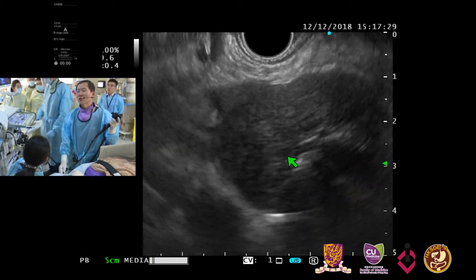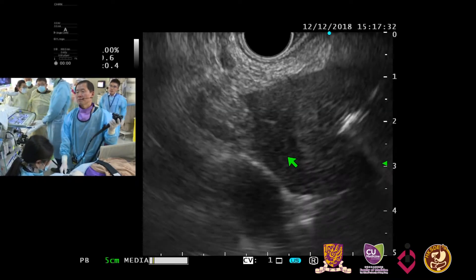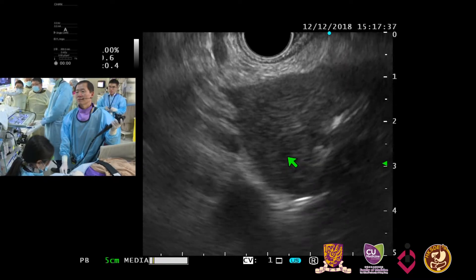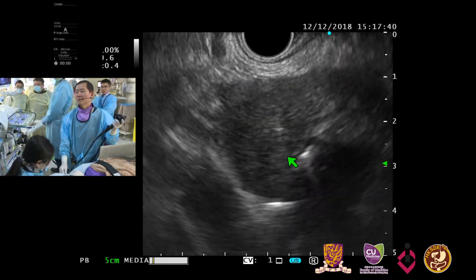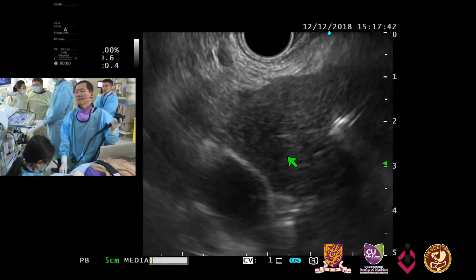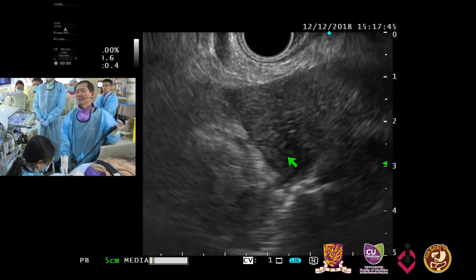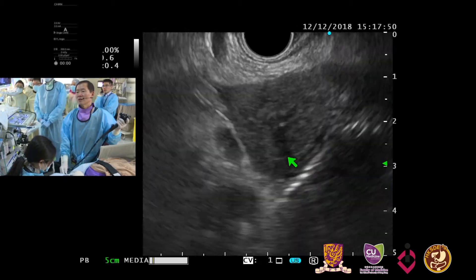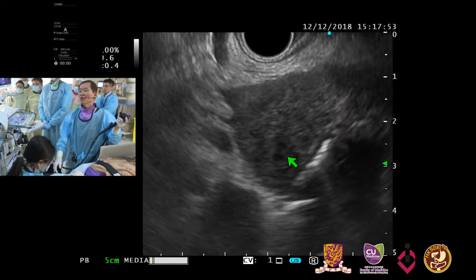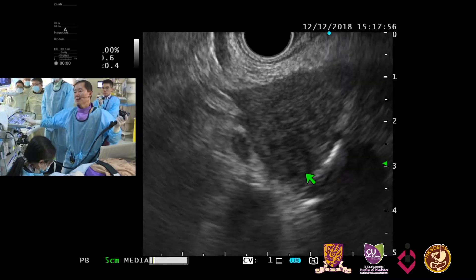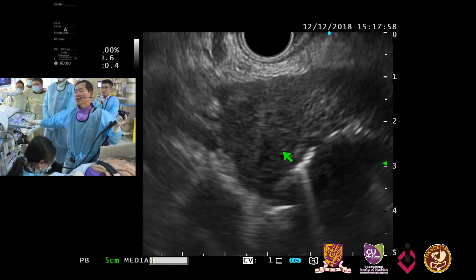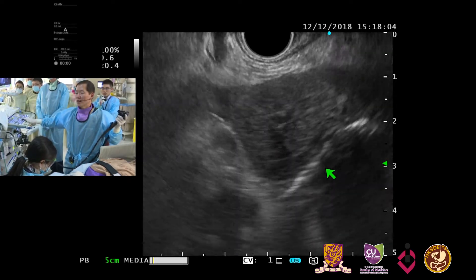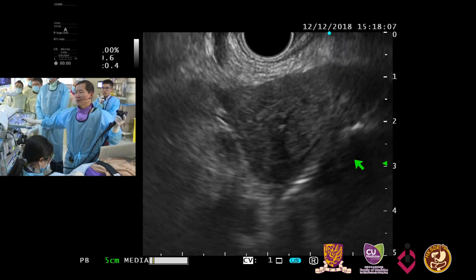What is the panel's opinion on this case? I agree — the lesion right now is immature. It's very subtle to identify and does not look fully liquefied, so you would not get adequate drainage even if you placed a stent. Probably better to wait. It looks like there may be some air, but I think that's just contrast. This patient already has a lot of air because of RPC and probably had several procedures, and also had the liver resected. So this is all pneumobilia going to the right side of the liver.